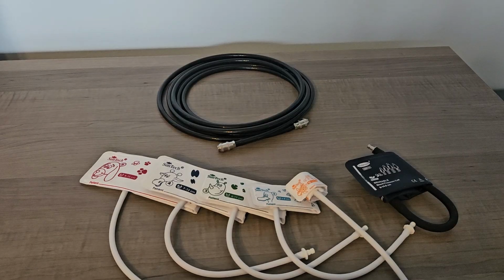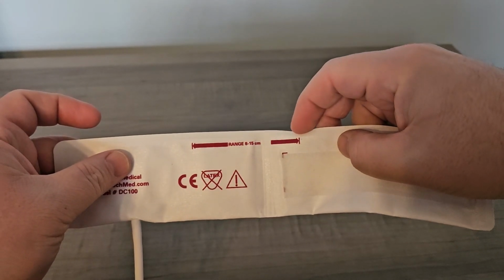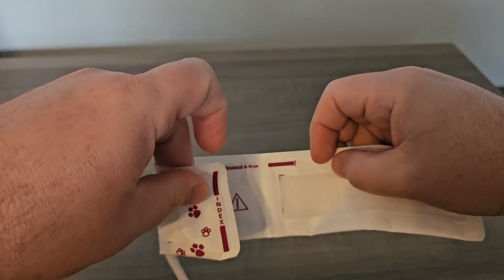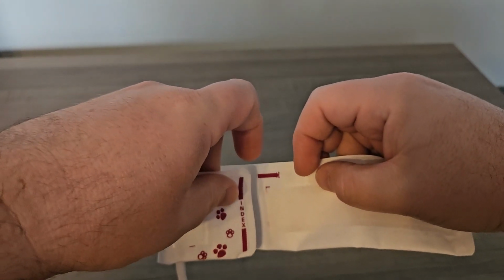Your monitor will include a selection of disposable blood pressure cuffs to monitor non-invasive blood pressure. Proper cuff size selection is vital to ensure proper blood pressure reads. Each cuff contains a graduated scale on the inside of the cuff. The index point on the leading edge of the cuff must fall within the graduated scale, or else the cuff is the incorrect size for the patient.